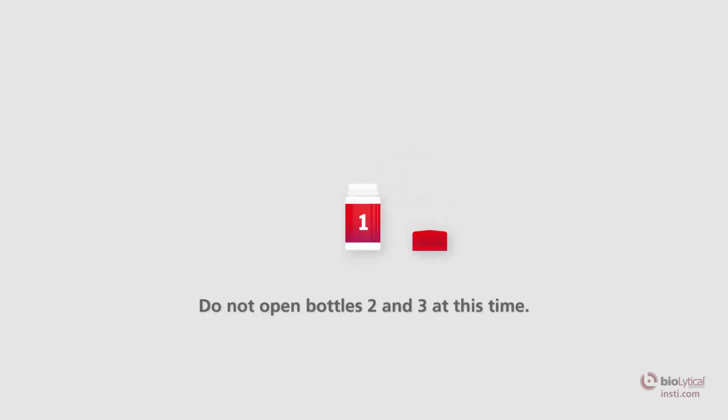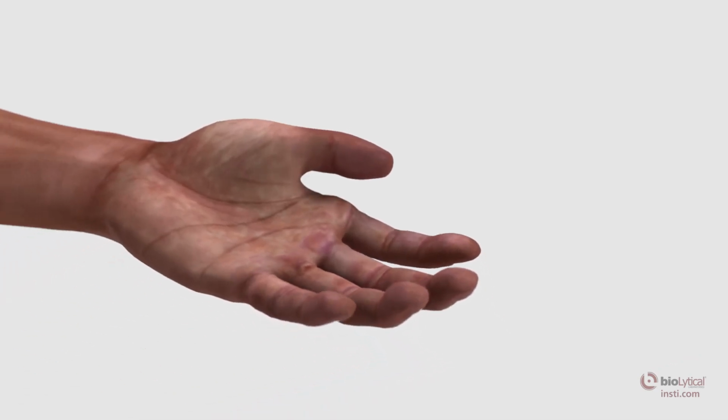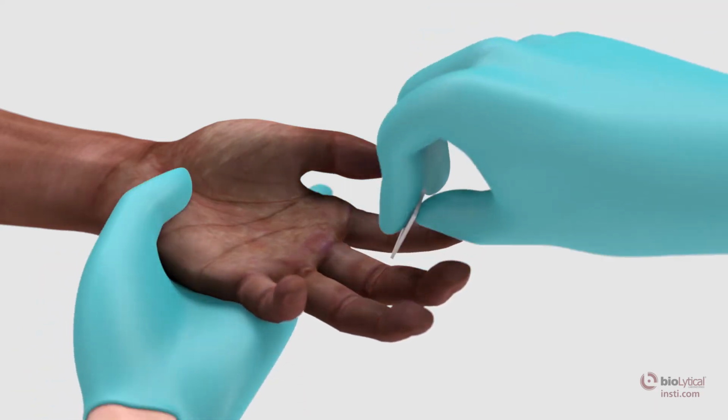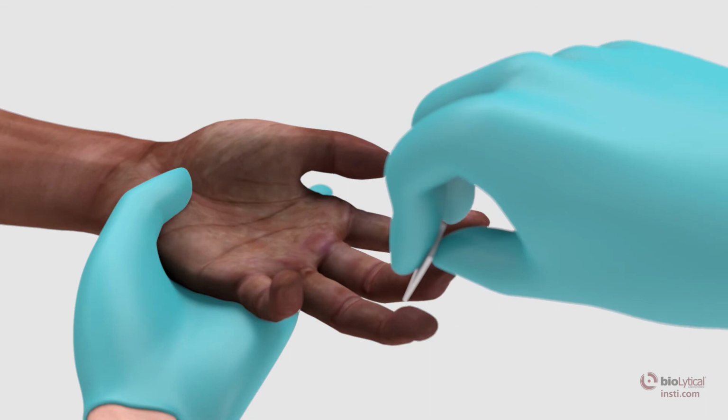Fingerstick blood collection. Collect the fingerstick sample using the capillary pipette. First open bottle number 1, the sample diluent, and retain the cap. Position the patient's hand in a way that is comfortable for the patient and allows you to easily press his or her finger to collect blood. The hand should be positioned at waist level or lower. Wipe the fingertip with an alcohol swab. Allow the finger to dry thoroughly.